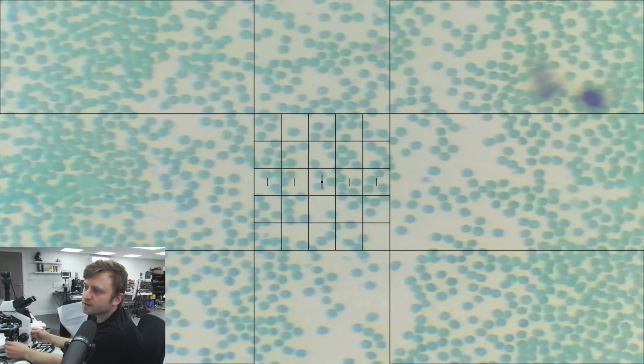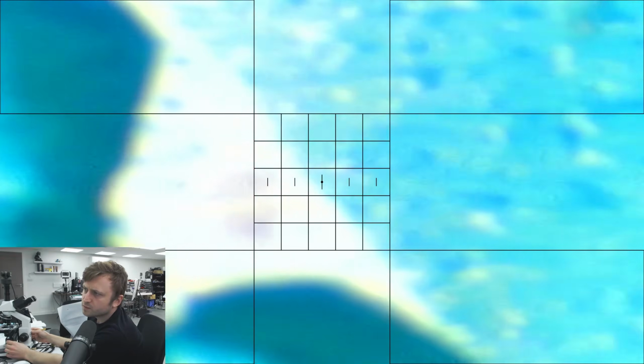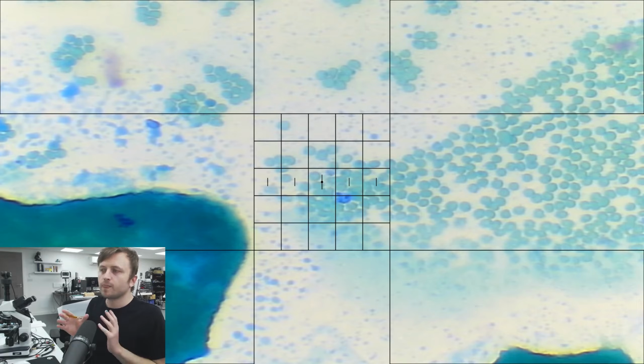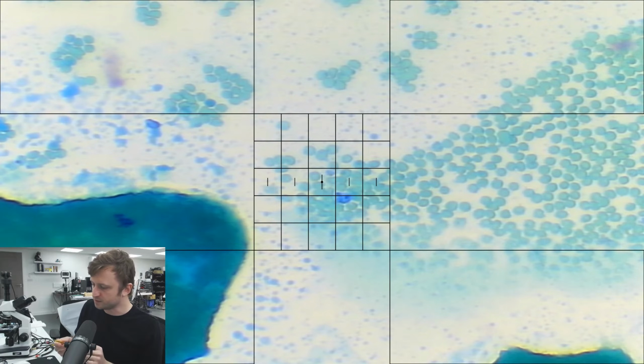So let's reset that. I need to pick a starting point that's not near an overclumped area. I think this was my original marker. So again, to clarify, I am learning. So if there's any scientists, especially people with a history in hematology watching, I know this is going to be wrong. I am working on the next part of the staining process, but just for the practice of it, I figure I'll try doing an inaccurate differential count.